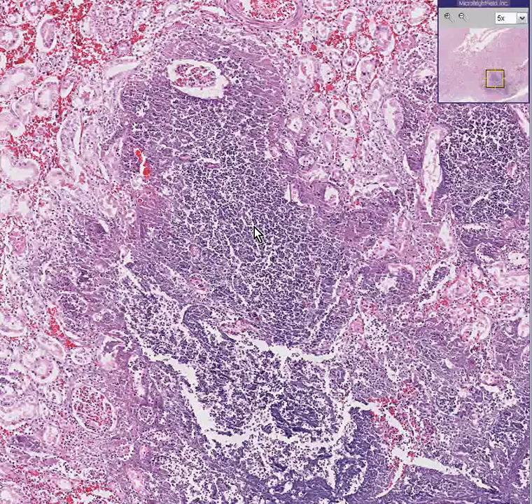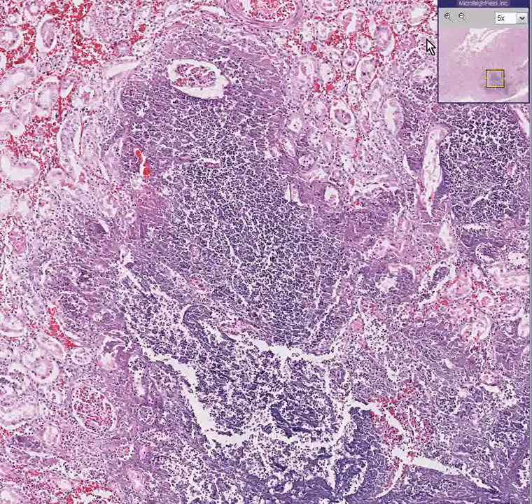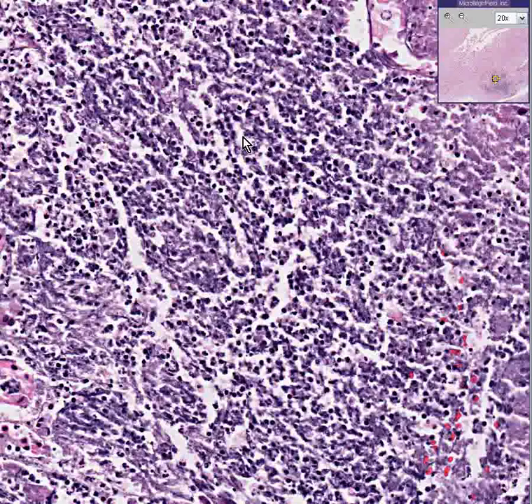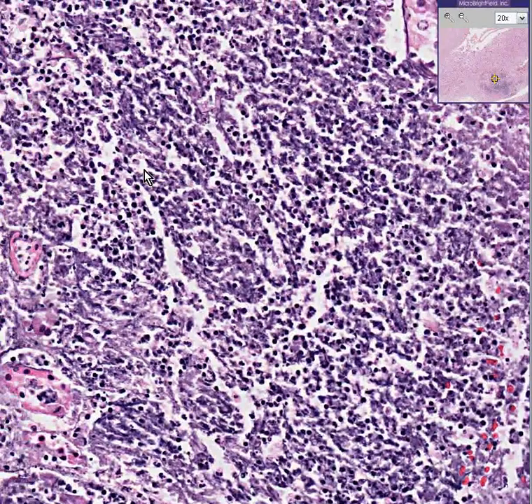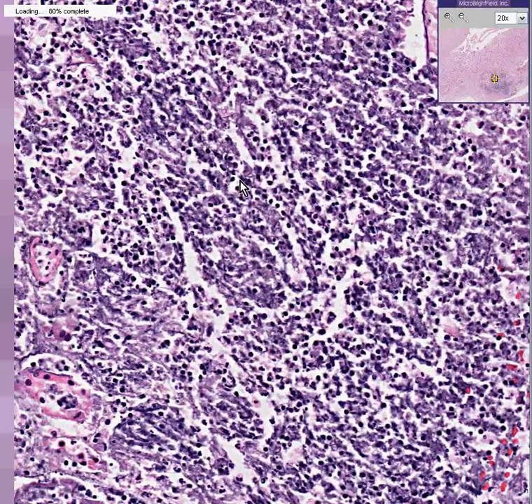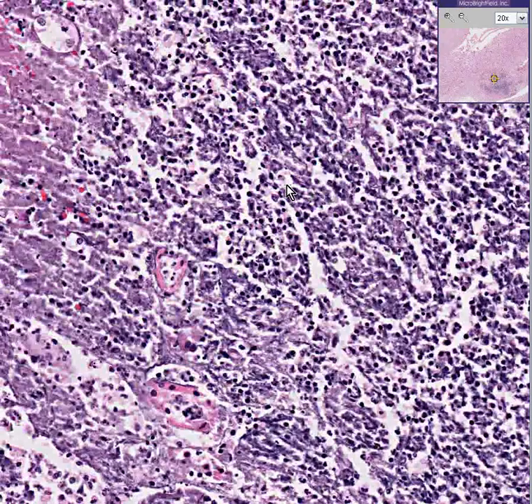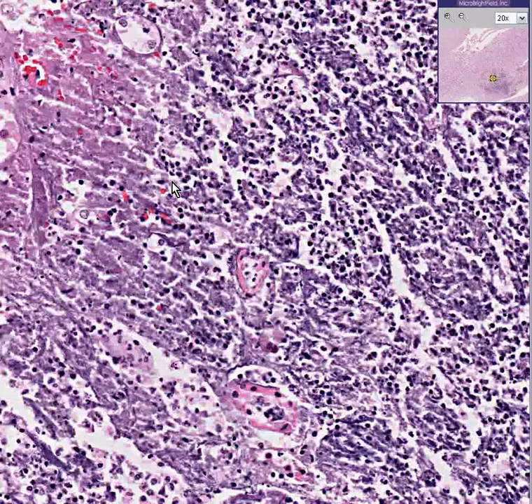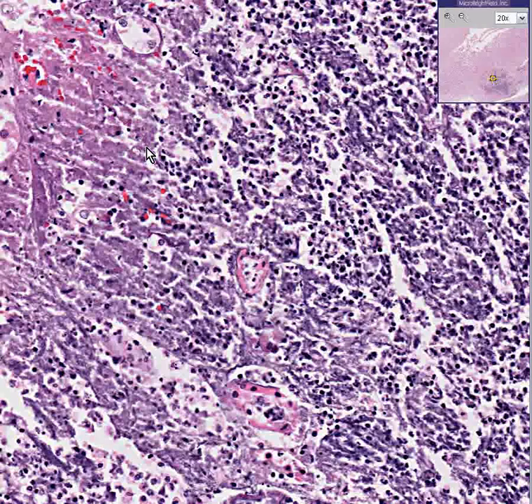This is a Pseudomonas abscess of a kidney. If you cultured this, you could grow out Pseudomonas. And if you had a really good high-power microscope — I only go to 20x — you may very likely see some rods, gram-negative rods in here as well.